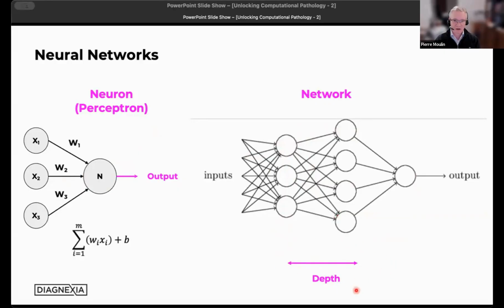This is why we call it a deep neural network. The number of layers, roughly, I hope there is no data scientist on the call, roughly represents the depth of your network. And this network, the combination of inputs and processing through the different nodes, we also call these neurons nodes, is giving you the output you want.